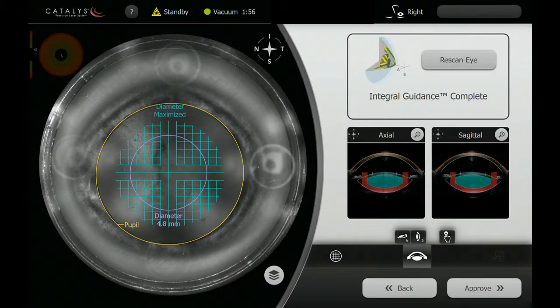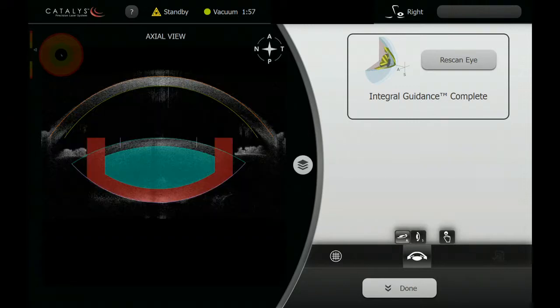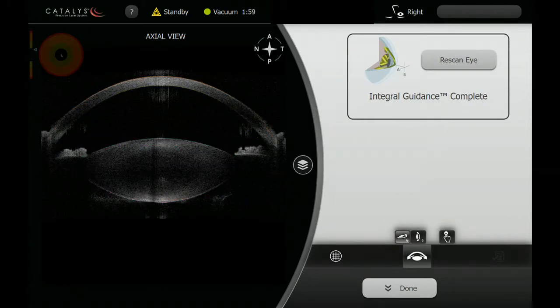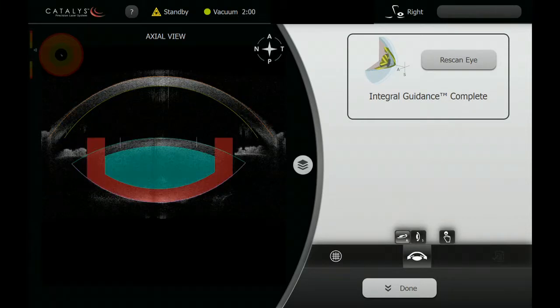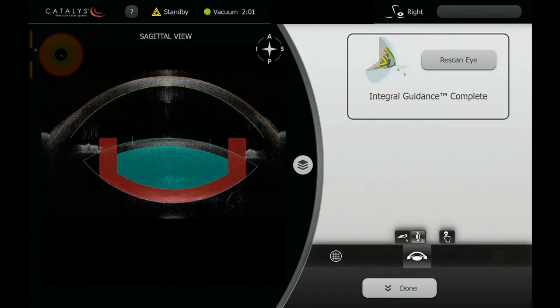At this point in the video, you can note that we've obtained scans of the front of the eye, and we are confirming fits, both axial and sagittal.